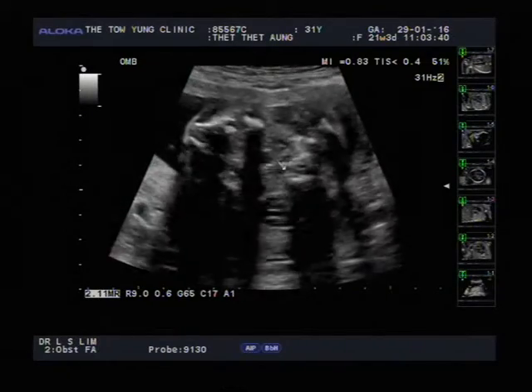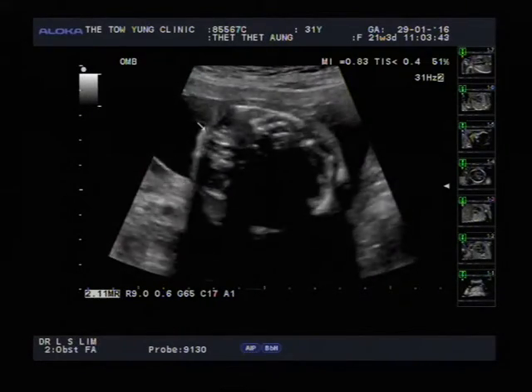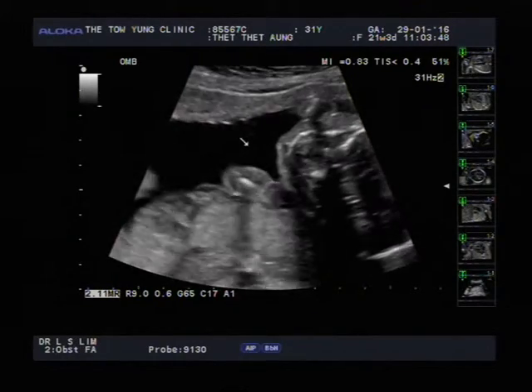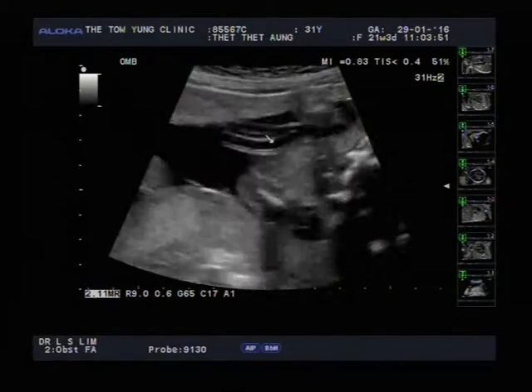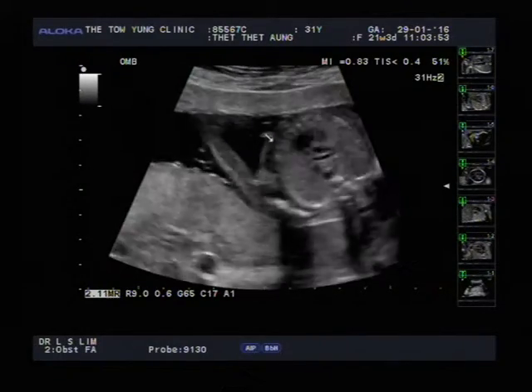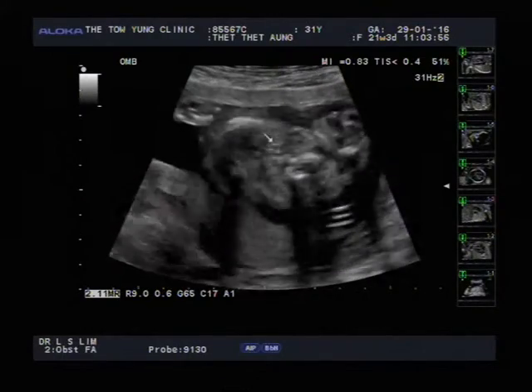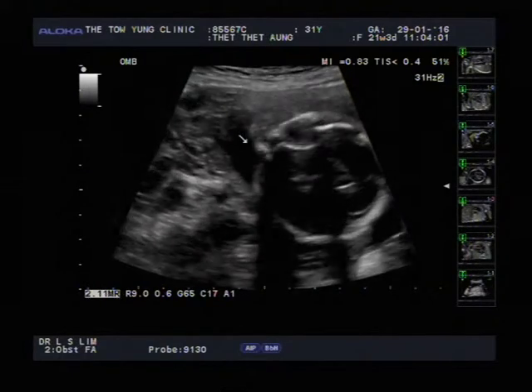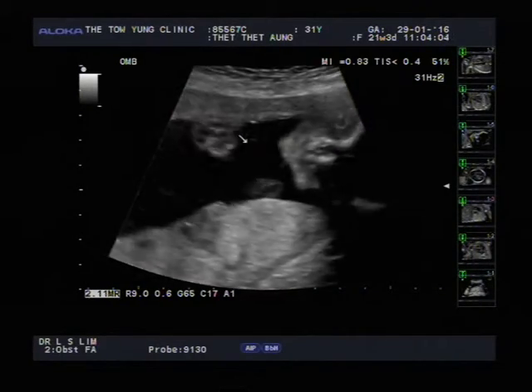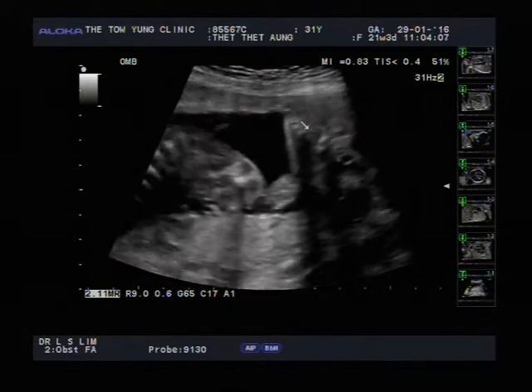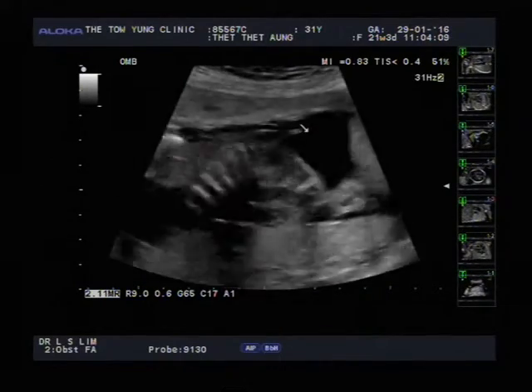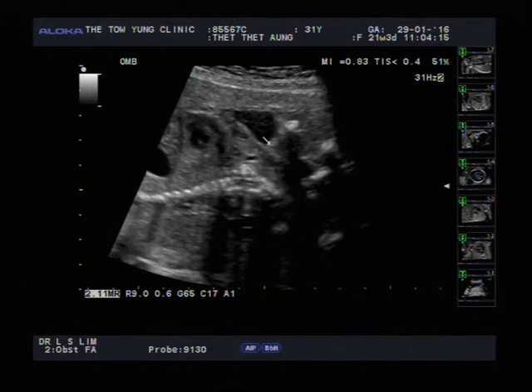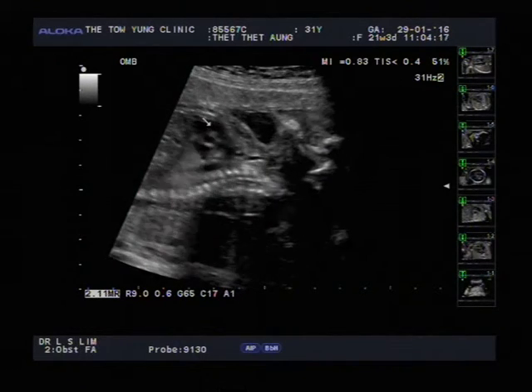Let's go back to the head and brain — there's the nose. I must say, your baby is very active and moving a lot, that's for sure. The head is just moving. This is the baby's neck — the back of the neck is over there. And now you can see the heart beating.